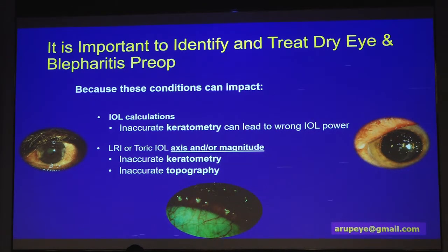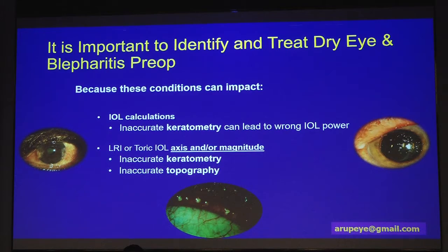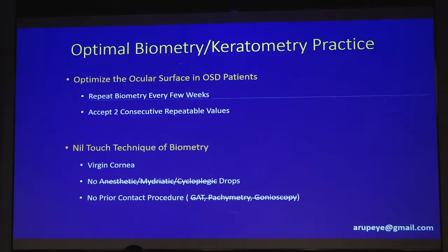We first look at the ocular surface. Over the last couple of years, we have learned that an abnormal ocular surface can definitely have an adverse impact on the keratometry, the magnitude of astigmatism, as well as the axes of astigmatism. So whether you're planning for a toric lens, a non-toric monofocal or a multifocal lens, your results will go haywire if you have not taken care of the ocular surface. After an ocular surface assessment, if the patient is found to have a deficient ocular surface, I would put the patient on treatment, optimize the ocular surface, and repeat biometry every few weeks till I get two acceptable and repeatable values, two consecutive ones.